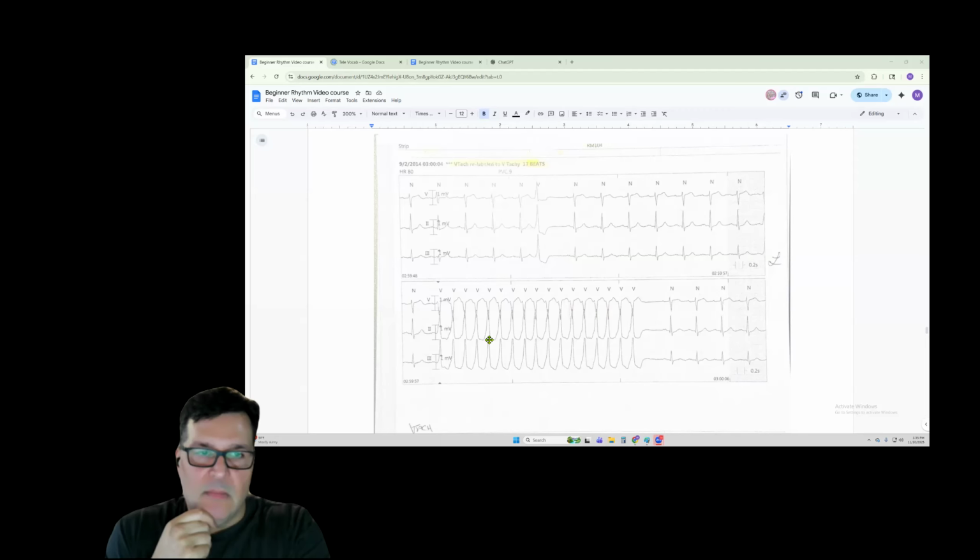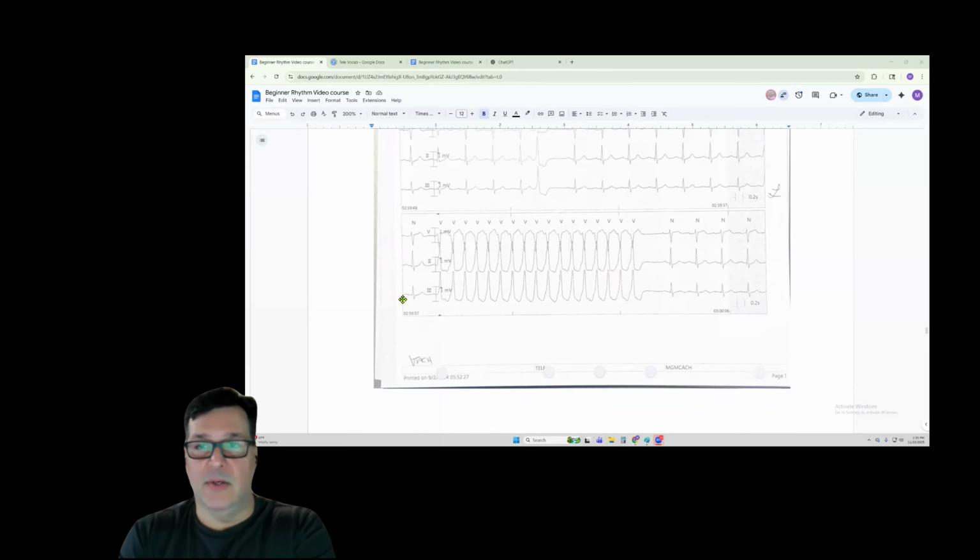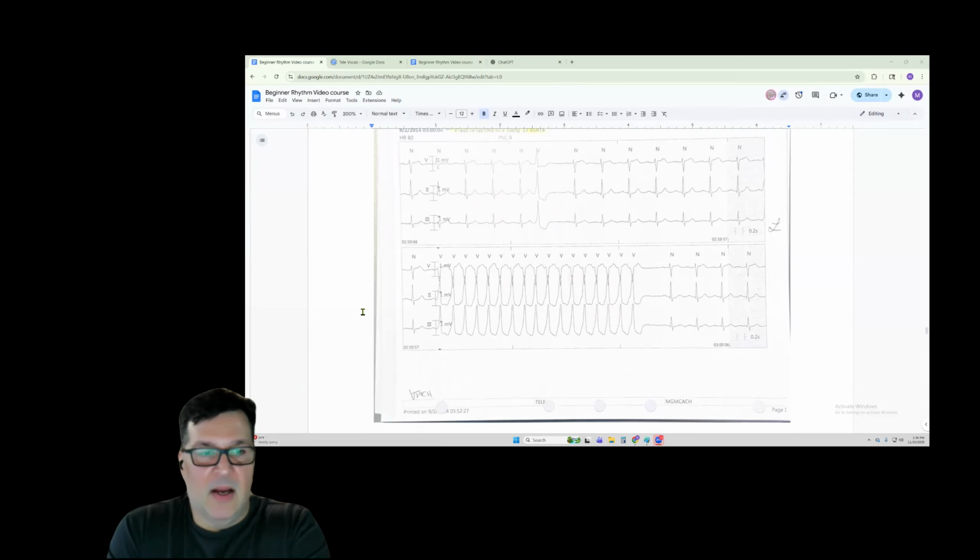And so what does that look like? You said that's not good for the patient. What would you do if you saw that? So immediately contact the nurse. If you can't get a hold of the nurse, use your escalation. If you can't get a hold of the nurse, you call the charge nurse.